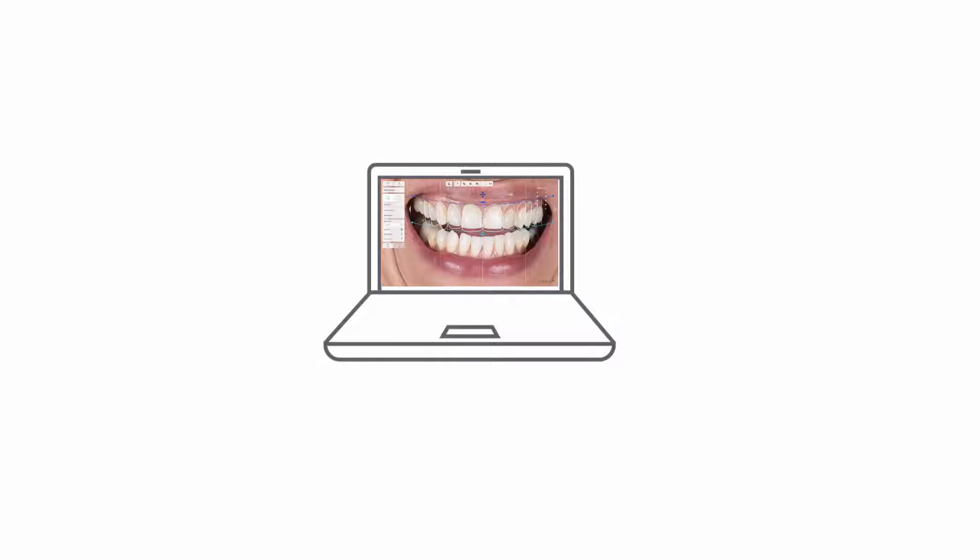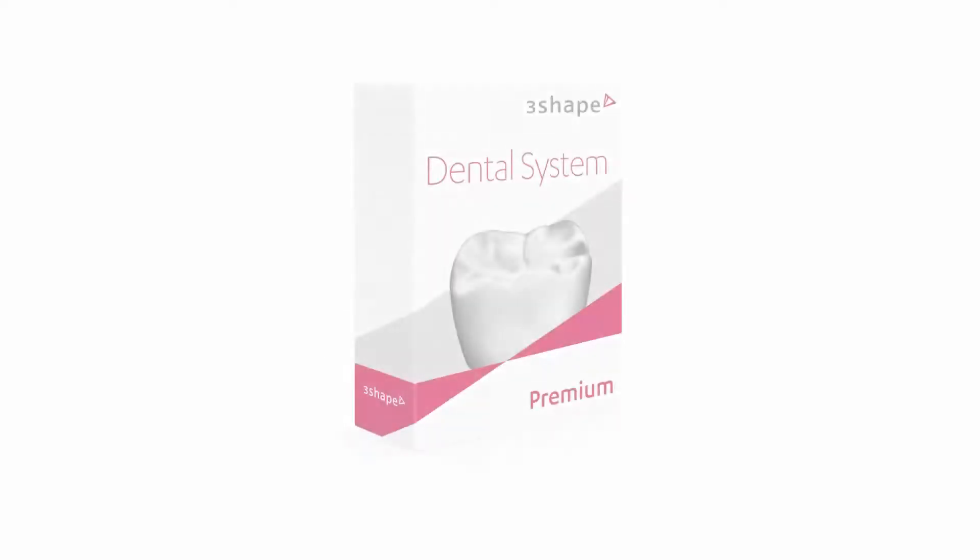However, if it is installed already, the Smile Design version can be updated but not downgraded. Installation of 3Shape Dental System consists of the following steps.